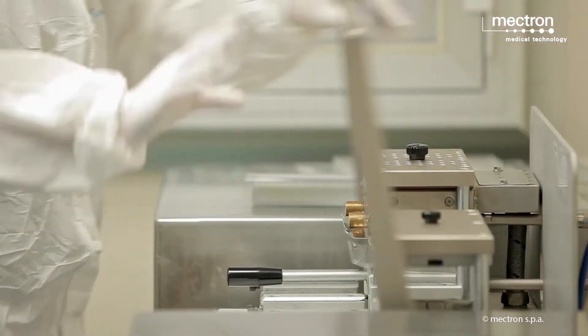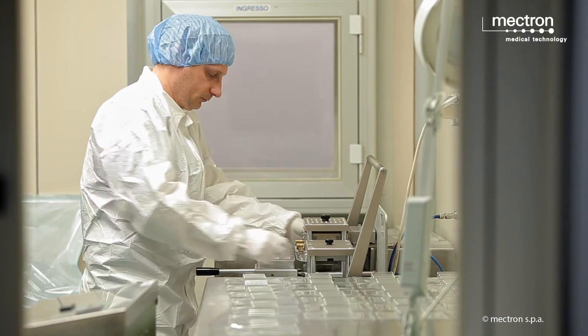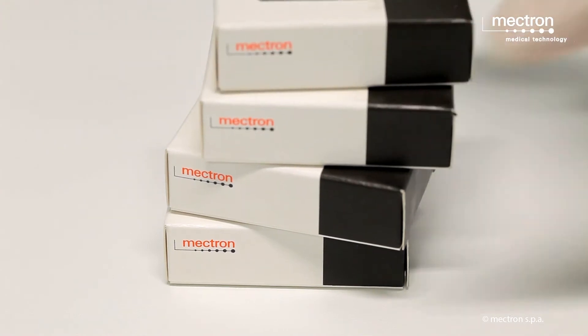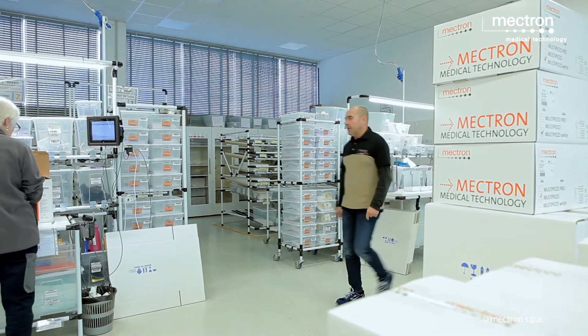All medical inserts are blister packed in a grade 7 clean room, then sent to an external contractor for sterilization. Final packaging and labeling of inserts are done in a grade 5 clean room, and the finished inserts are then sent to the shipping warehouse.